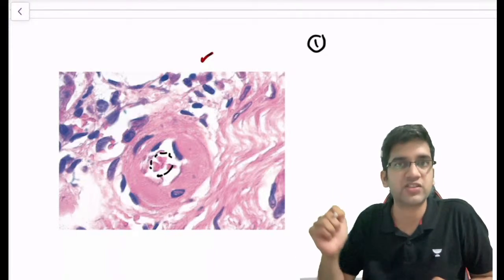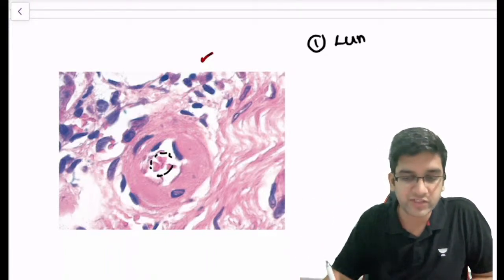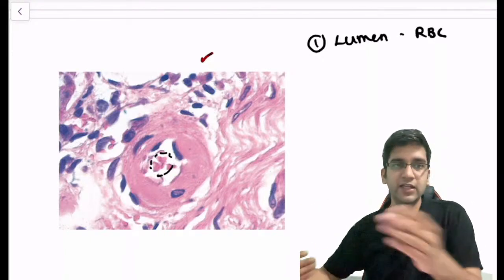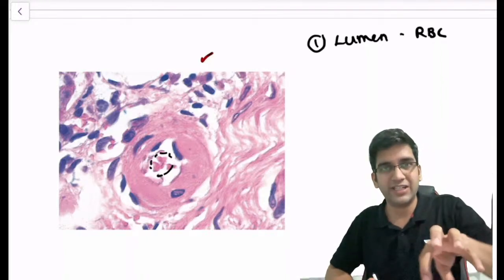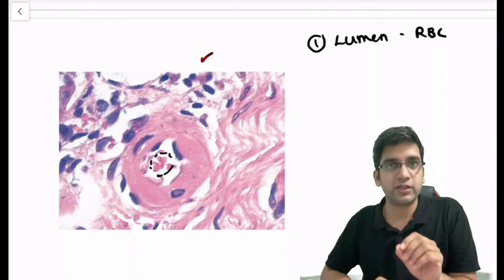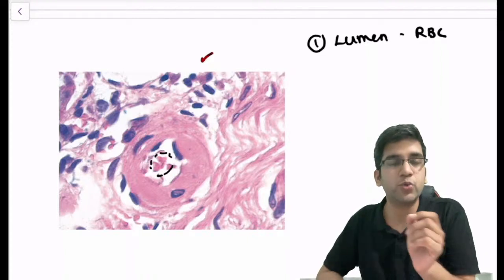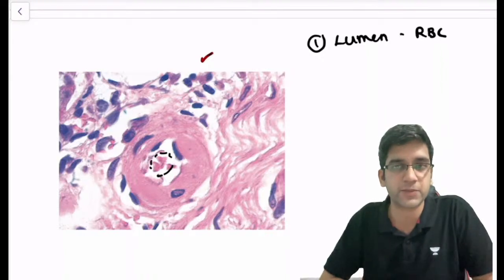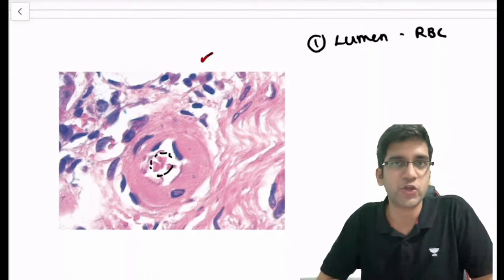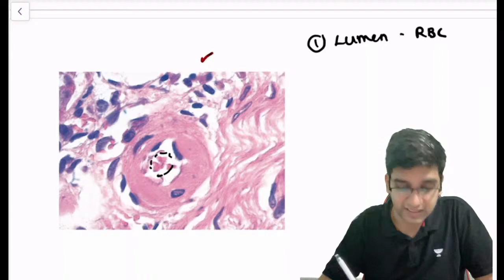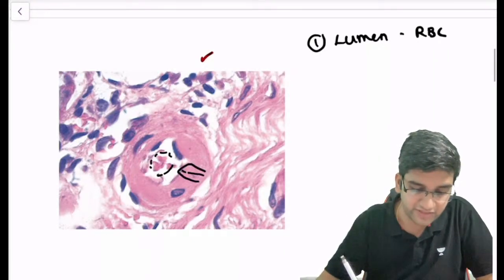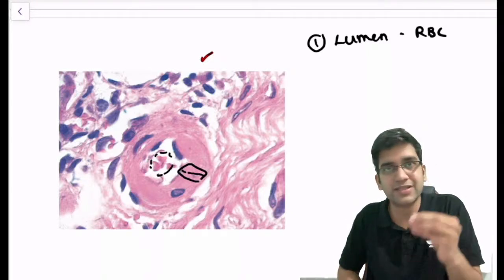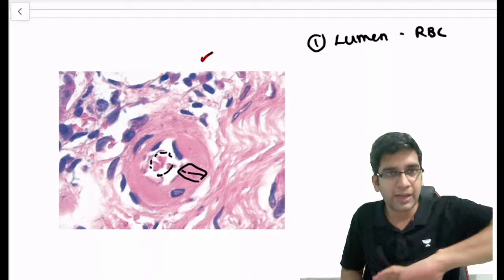Always look for the lumen. Most of the time lumens will have RBCs, so I can easily know it's a blood vessel. Now I said it's an arteriole or a capillary — in general, for an arteriole or a capillary, the tunica media will be very very thin. But here it's definitely a very thick tunica media for an arteriole or a capillary, which means something else is deposited in the tunica media.